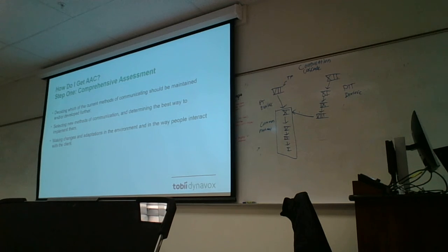We'll talk about how to get an AAC device. The process generally starts, like I said, when either a family member or an SLP finds out about Tobii Dynavox by word of mouth, Google, or our website. If they reach out to me, I'll ask, are you connected with an SLP? The speech language pathologist is crucial to the whole process and to start it. So you as the SLP would be the one to start doing the evaluation.